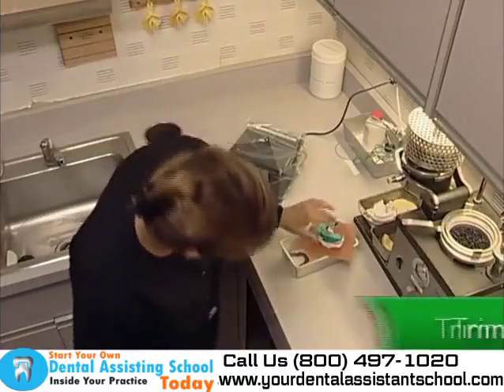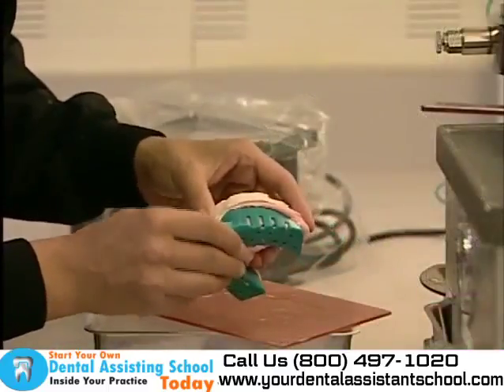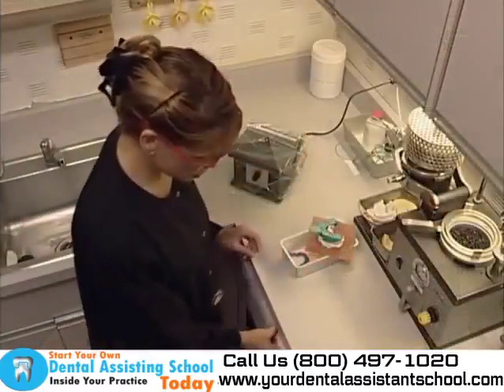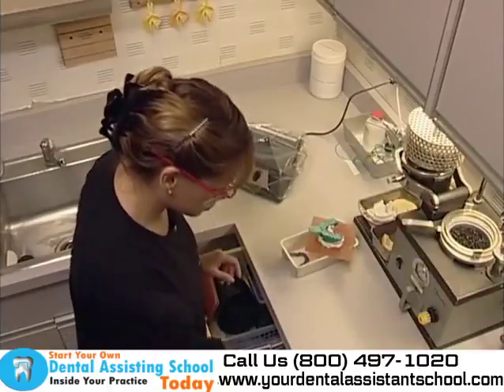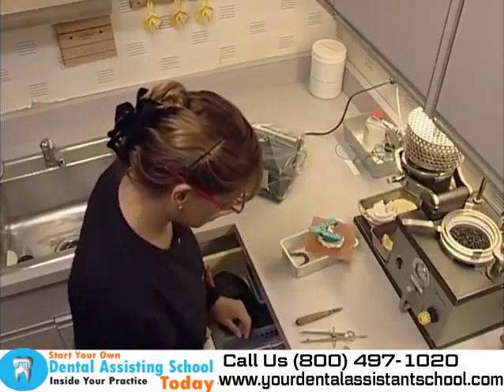Once set, the material is cool and dry to the touch. The study model is then separated from the impression tray. The model now needs to be trimmed. The proper equipment as well as the model are prepared.